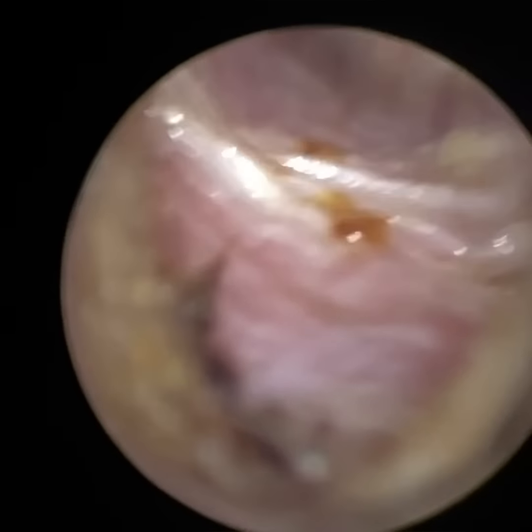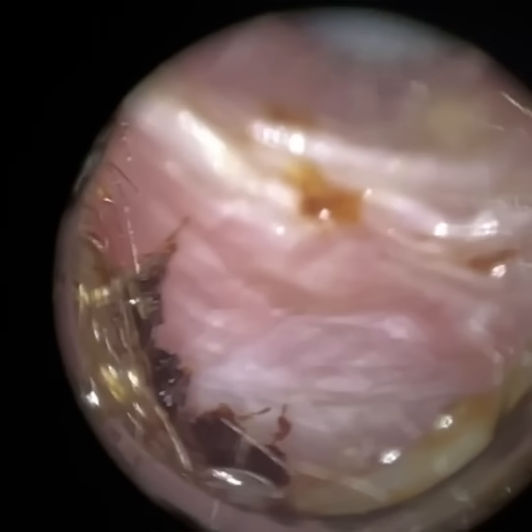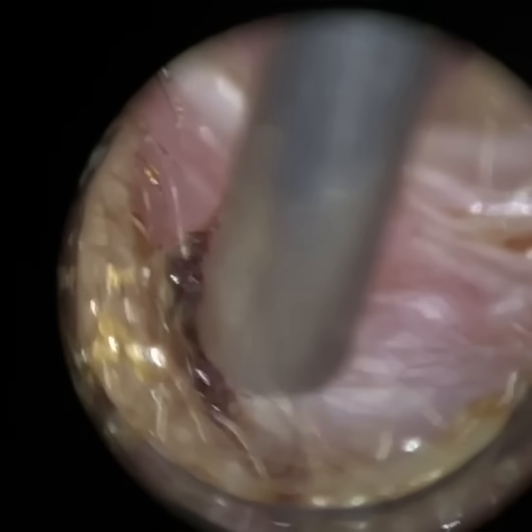wax skin just near the entrance. So I'm just going to get that in focus. So this is how you get depth perception. You just adjust the focus. I'm going to mop that away.